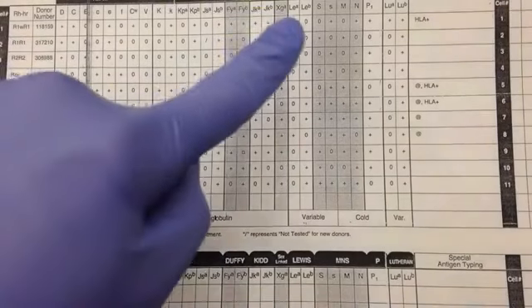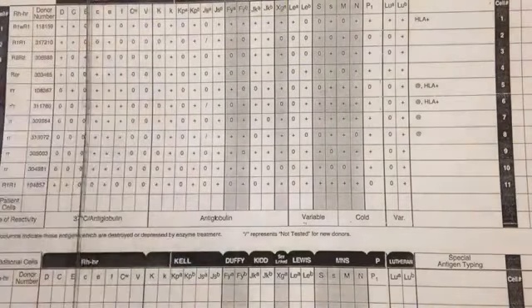Basically, the gel and the tube are done exactly like the screens are, which I already have videos for. But essentially, an antibody panel uses red blood cells with known antigens to identify unknown antibodies in patients. As you can see, the antigens are listed at the top, and all the pluses and zeros that you see there are basically what antigens are present on the red blood cells and which ones aren't. So in this, we're going to be testing patient plasma.